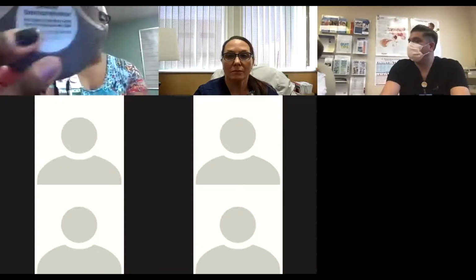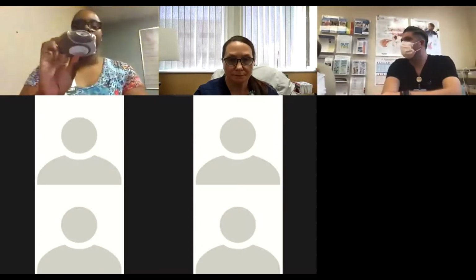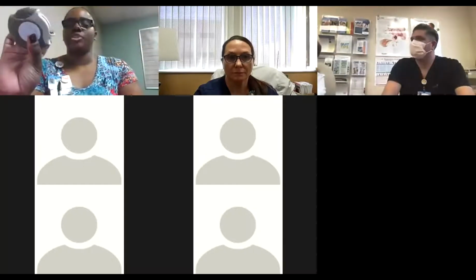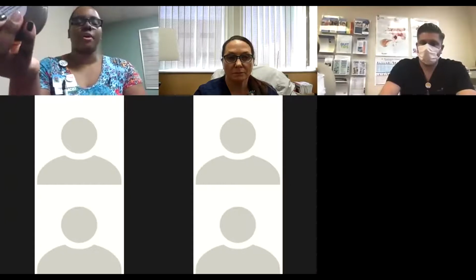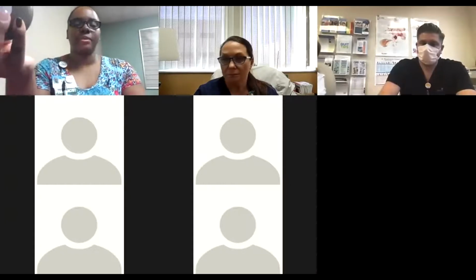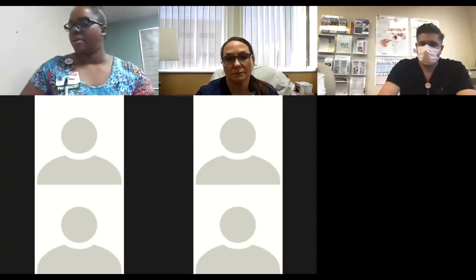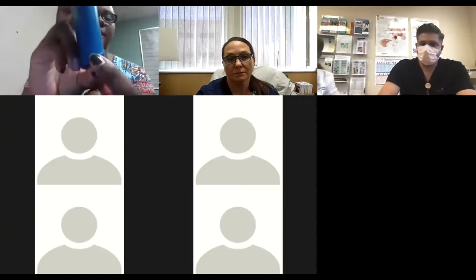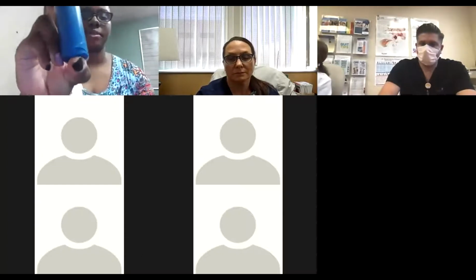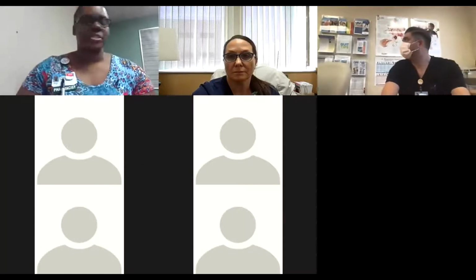Something that's really neat about this is that it actually has a counter. I don't know if you can see it, but the counter just tells you how many doses you have left. So if you start getting really low, then you want to make sure to call your pharmacy and make sure that they have the inhaler in stock so that you don't run out of medication. Actually, the puffer inhalers have them too. This one doesn't have it, but usually it would have these numbers back here that tell you how many doses you have left as well. All right, so that's my demonstration on the Diskus.